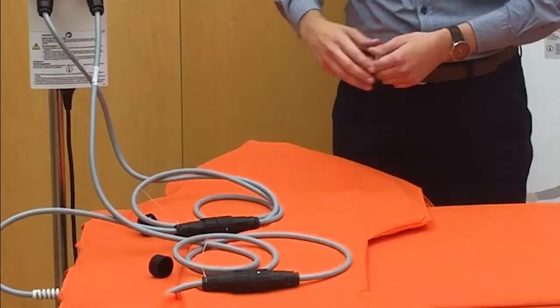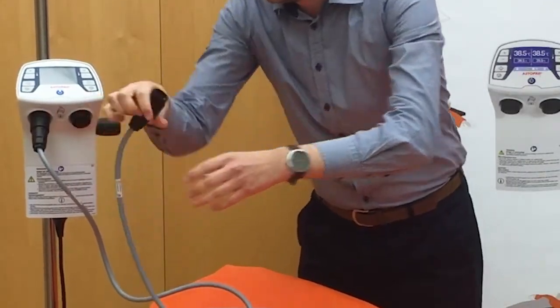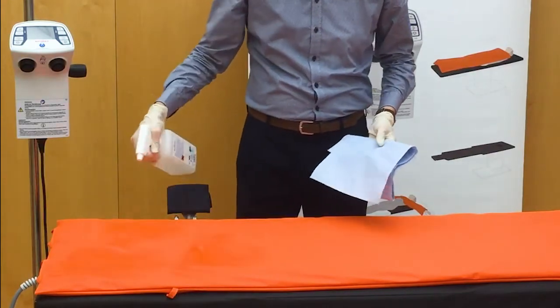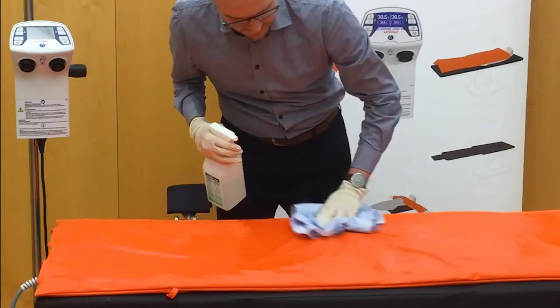In the next step, disconnect the blankets and connecting hoses from the Astopad control unit. Our last step is to clean and disinfect the Astopad as needed according to the instructions for use. First, clean all surfaces of the blanket with a soft cloth and a mild soap and water solution. To disinfect the components, use only the approved disinfectants listed in the Astopad manual. After cleaning, disinfection, and drying, the Astopad patient warming system is immediately ready for use by the next patient.